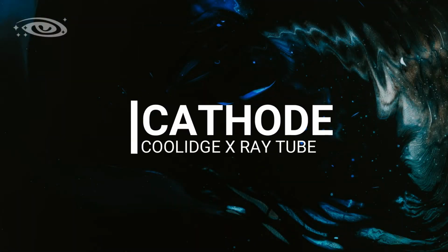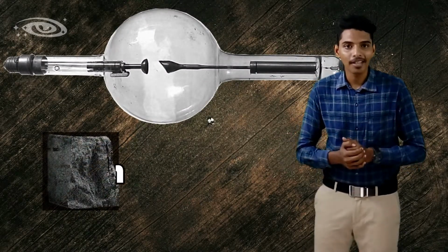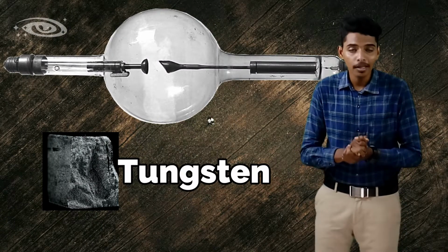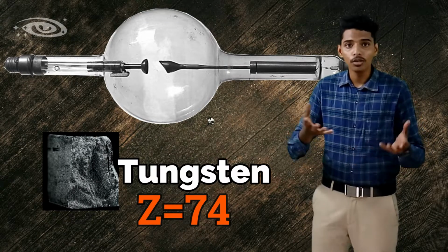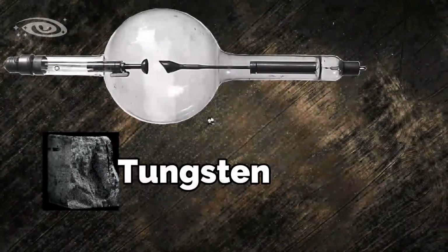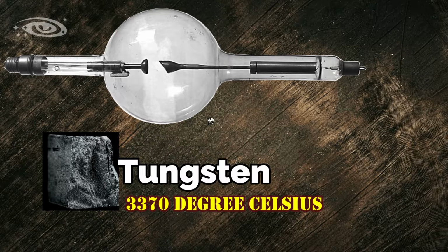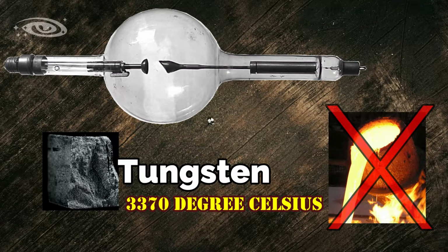And now we'll see the construction of the cathode. Here in the Coolidge X-ray tube, the cathode is made of tungsten. The reason for using tungsten is that because of its high atomic number, that is 74, it can produce more electrons due to thermionic emission. And also because of its high melting point, that is 3370 degrees Celsius, it can withstand an enormous amount of heat during thermionic emission so that it does not melt down quickly.